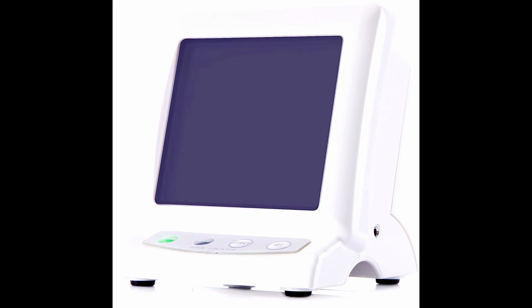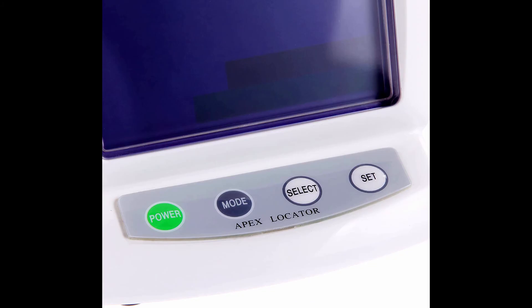Without any operation for 5 minutes, it will turn off automatically. New alkali dry cells can work for 100 hours continuously. Soft alarm sound can be chosen from three kinds of timbre, with adjustment of volume or without voice. Patients only undergo a little test electric current, so they will not feel any ache — a very comfortable treatment.